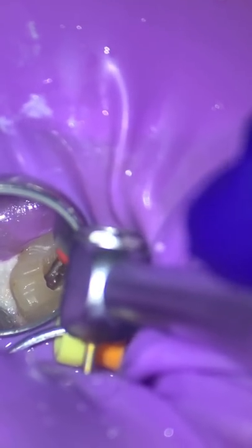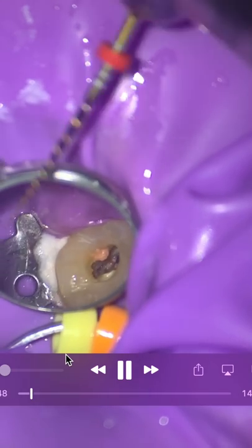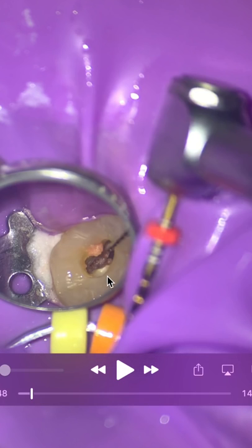So what I was doing was just removing the pulp tissue. One of the things I'll give you advice on, especially if you're doing dentistry and root canals, is to take a look at one of the videos, especially by Ali Nassay, talking about a PSA and anesthesia for maxillary teeth.